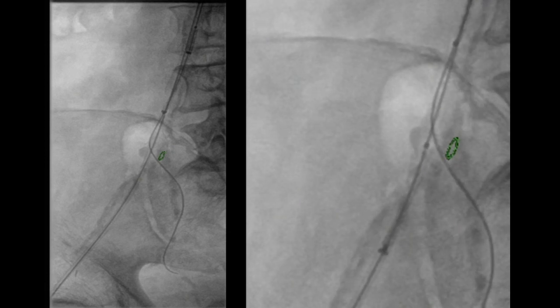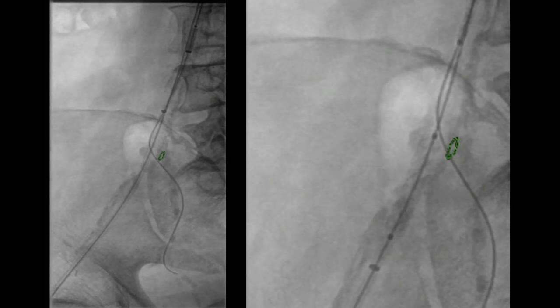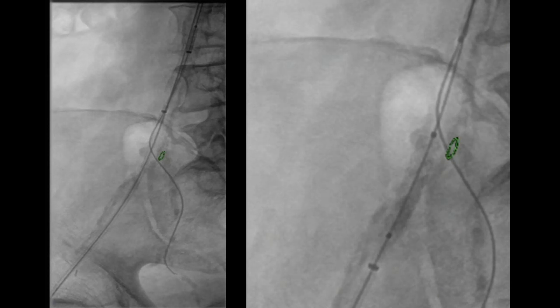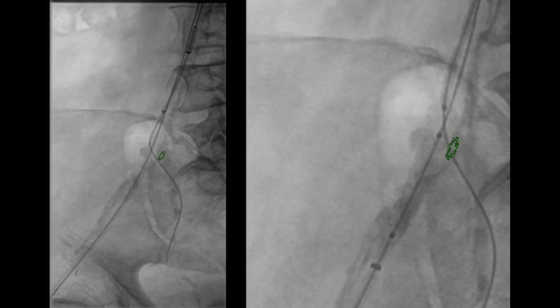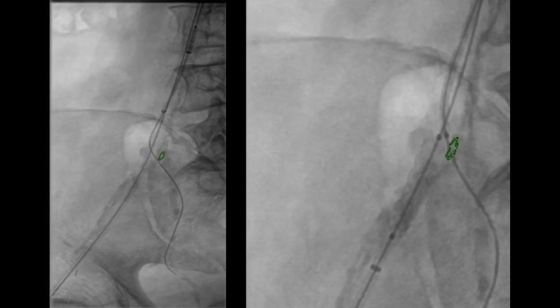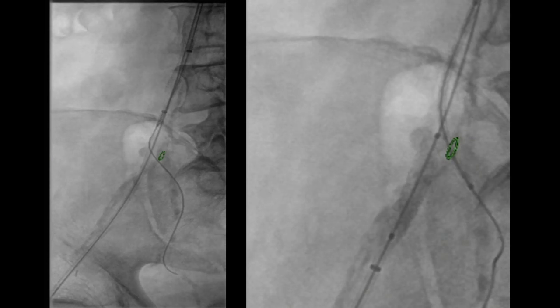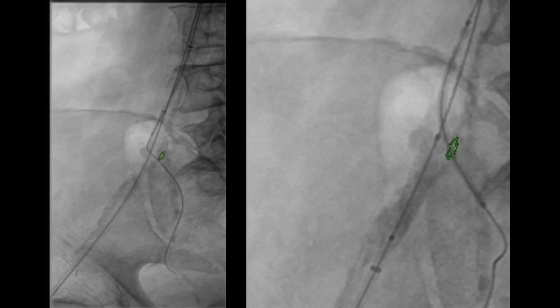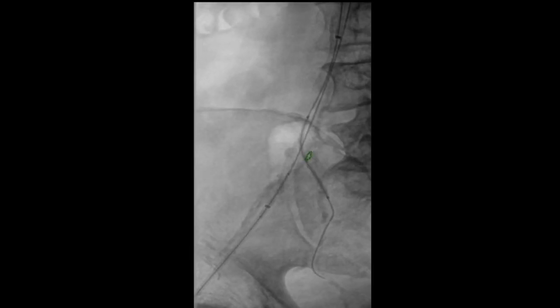You can see the VBX being inflated flush with the origin of the internal iliac. Once that was up, it stabilized the wire and prevented it from prolapsing down the external. We then brought up the VBX from the arm and it passed fairly easily down into the internal iliac. The plan was to use a 59mm stent which was 6mm in diameter and then place a separate external iliac stent to essentially use a kissing technique into the common iliac.